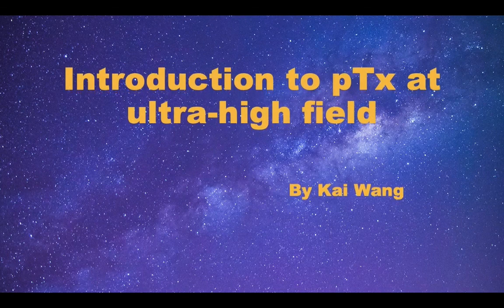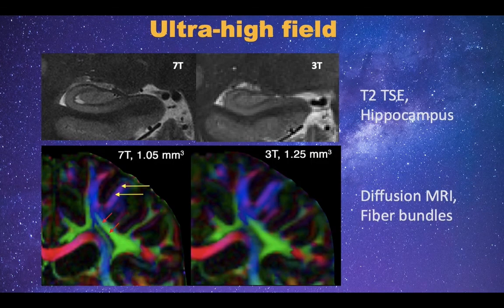Today I will give you a basic introduction to pTx at ultra-high field. You may have heard of pTx, but what does it stand for? How does it work? Why do we need it for ultra-high field? I hope after this video you will be able to answer all of these questions. Let's get started. First, I want to introduce to you the ultra-high field.